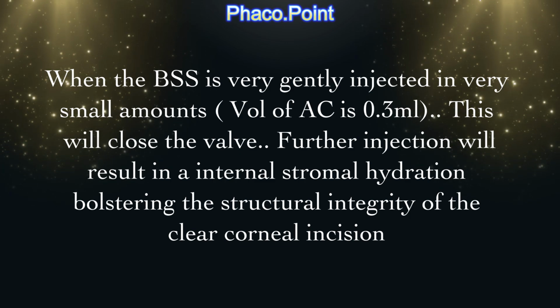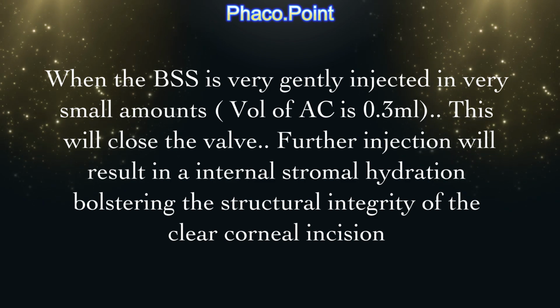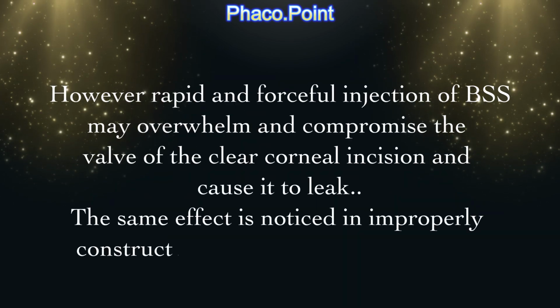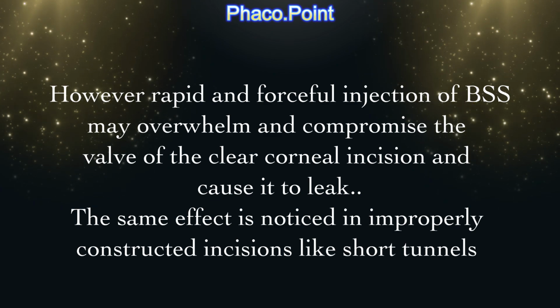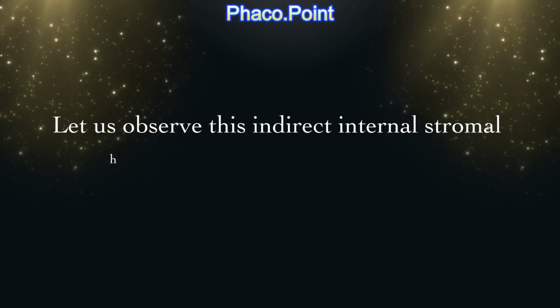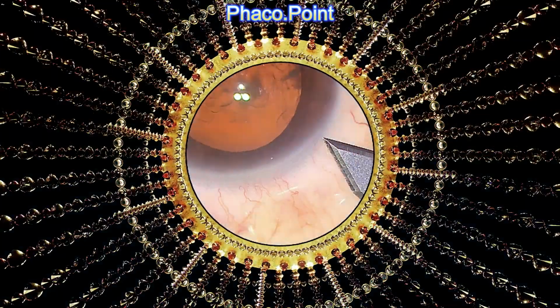Further injection will result in an internal stromal hydration which bolsters the structural integrity of the clear corneal incision. However, rapid and forceful injection of BSS may overwhelm and compromise the valve of the clear corneal incision and cause it to leak. The same effect is noticed in improperly constructed incisions like short tunnels. Let us observe how this indirect internal stromal hydration works in a few case examples.